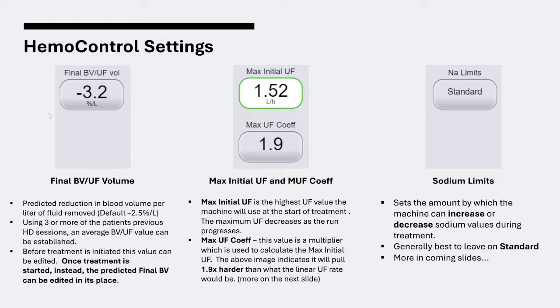It should certainly be revisited and reviewed with every patient as they gain or lose weight or their body type changes or their diet changes. Certainly consider this value and adjust it. It's not a one-size-fits-all. It's case by case, and it needs to be reassessed.